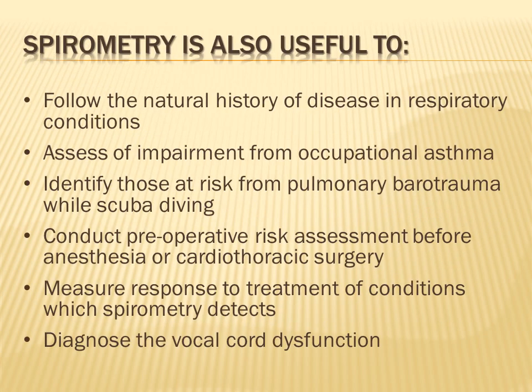Spirometry is also useful to follow the natural history of disease in respiratory conditions. This means if we have a patient who is complaining of a chronic respiratory disease and has done a spirometry test before, we will do a new spirometry test and assess if the condition has improved, stayed the same, or worsened.